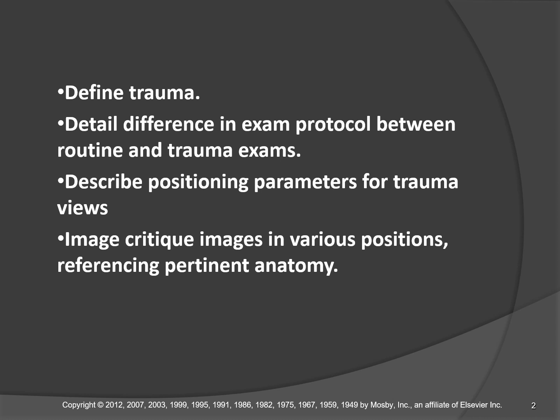So trauma presents a challenge in that you have to get the anatomy to display just right, but we can't manipulate the anatomy because the severity of the injury is such that manipulation would make it more unstable or exacerbate the condition of the patient and make the trauma worse. And so it's the special challenge of trauma radiography.